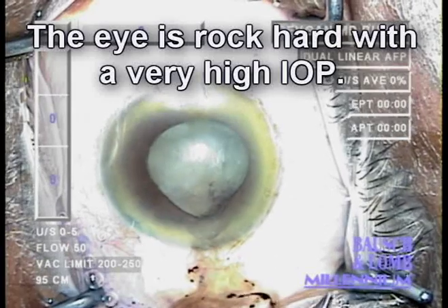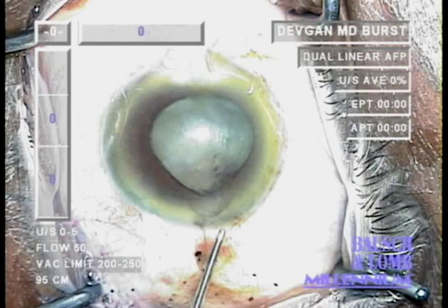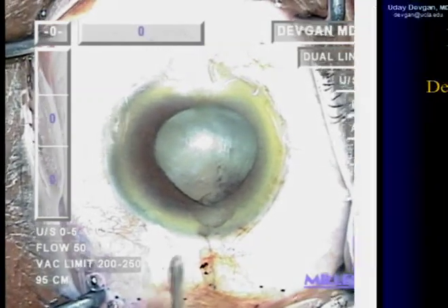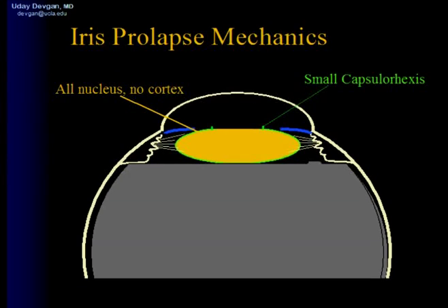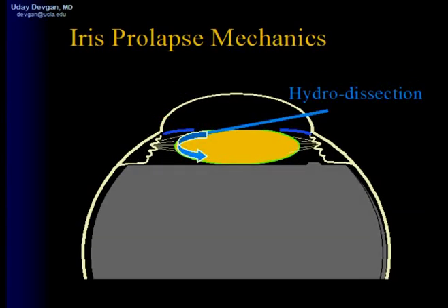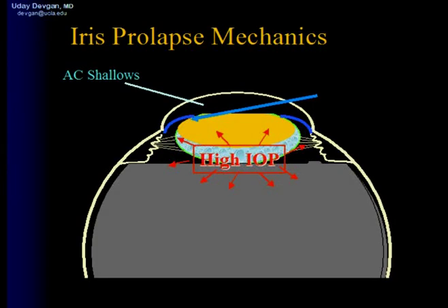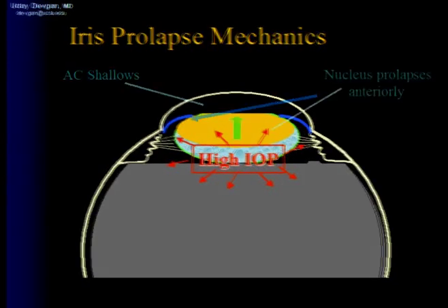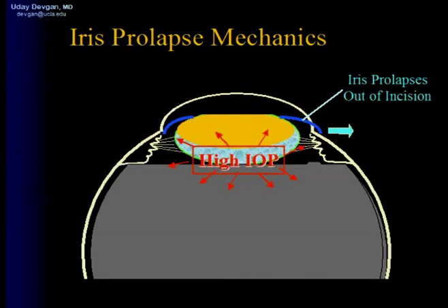The eye is rock hard right now and the intraocular pressure is very high. The patient is quite uncomfortable. So what's going on here? We have a very dense, large cataract. We ended up performing a relatively small capsulorrhexis. When we performed the hydrodissection, balanced salt solution became trapped behind the nucleus and that pushed the nucleus anteriorly. This caused a very high intraocular pressure rise, which caused the nucleus to move further anteriorly and the iris prolapses out of the incision.